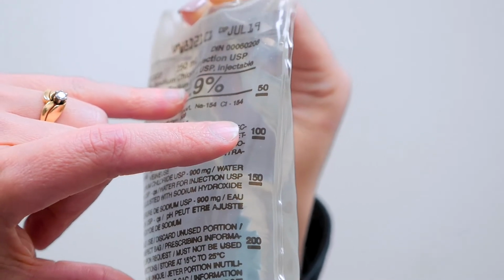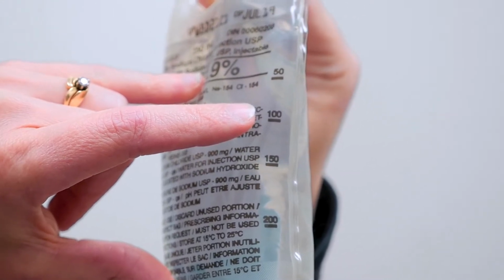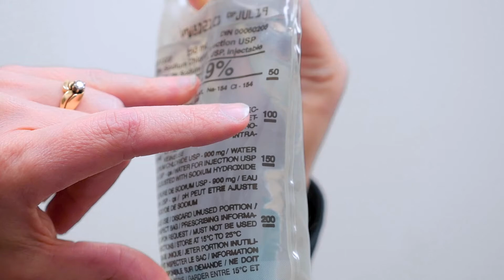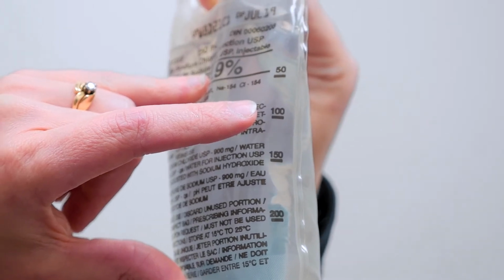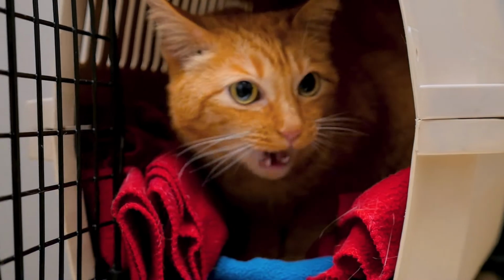Typically, a cat would be given somewhere around 100 milliliters at a time for your average cat, but that's something your veterinarian will give you specific instructions on if you are doing this. So once you're familiar and comfortable with getting the line set up together, we are going to now show you how to actually administer it to your pet.